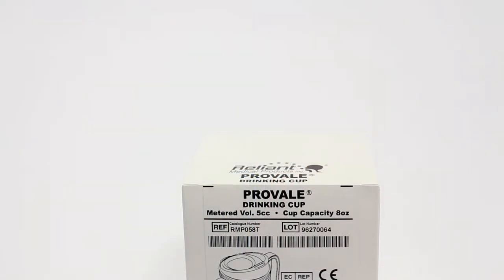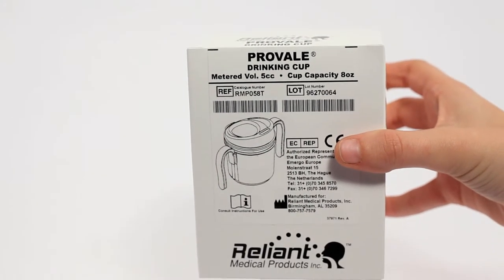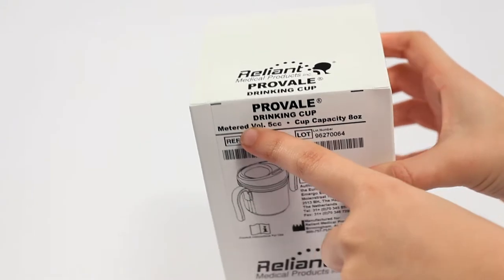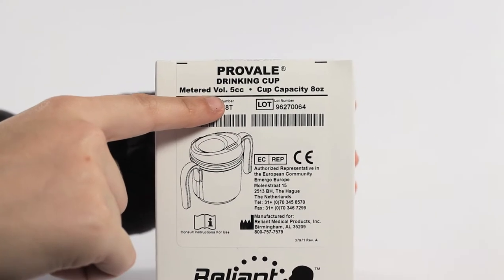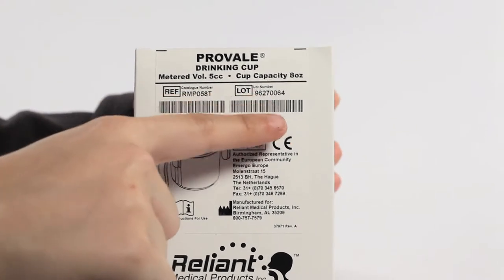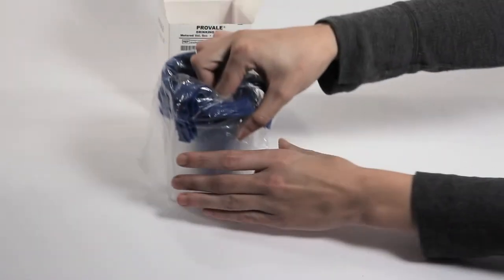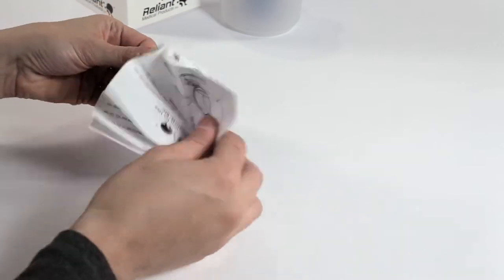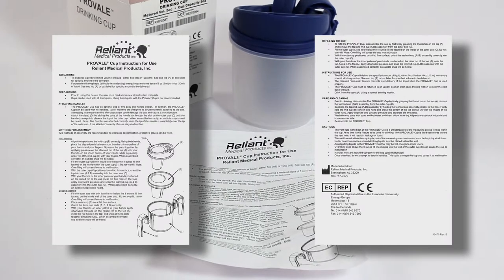The ProVail Cup is packaged in a paperboard box and protected in a plastic covering. Confirm that it is the product ordered and check to make sure the box has not previously been opened. Printed on the outside of the box are the product name, catalog number, and manufacturing lot number. Inside the box is the ProVail Cup and the directions for use, which contain instructions for assembly, filling, care and cleaning, and the product warranty statement. These instructions should be read thoroughly before using the ProVail Cup.